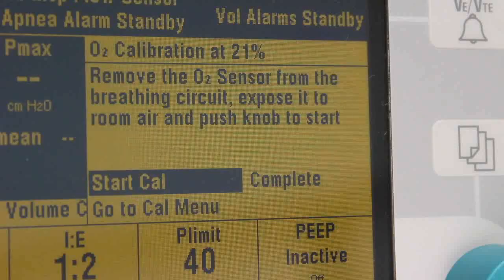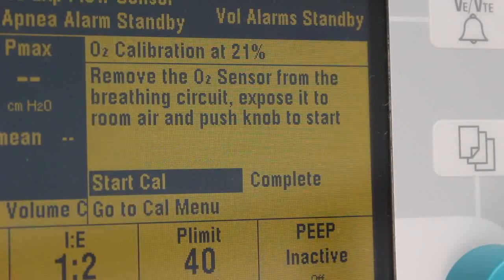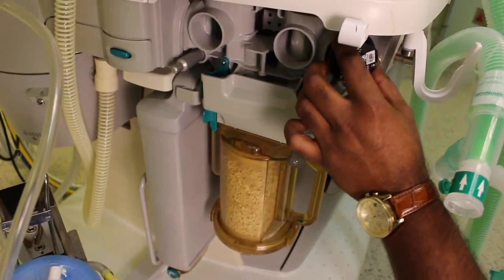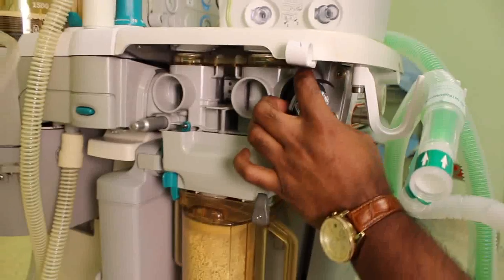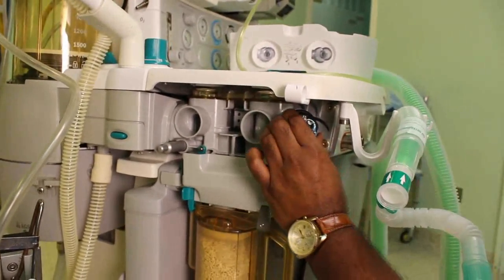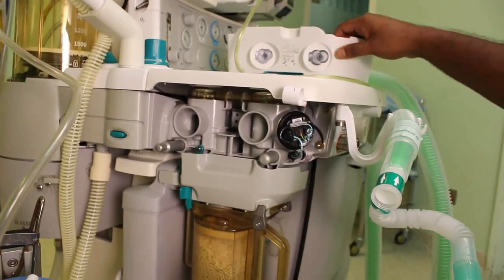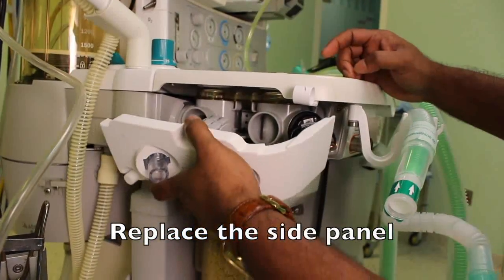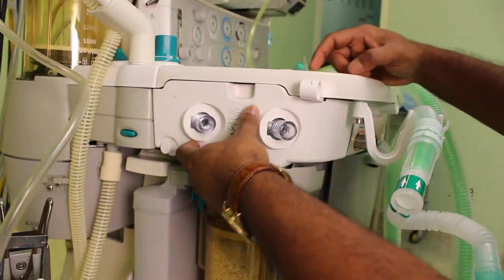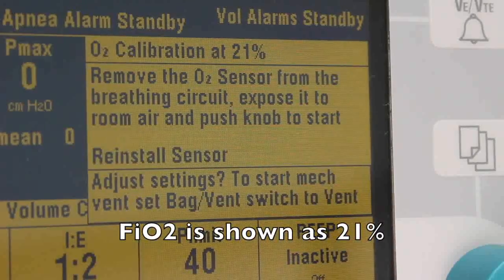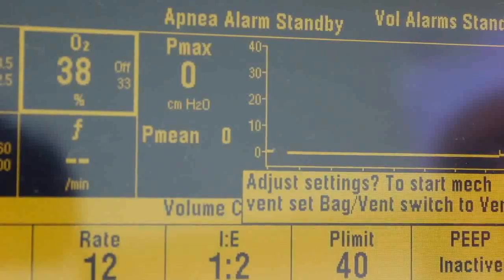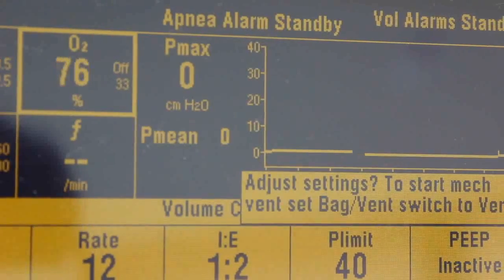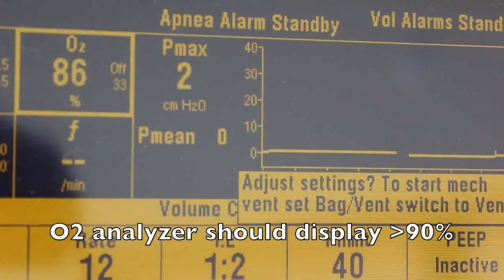Once completed, reinstall the sensor by rotating clockwise. Now replace the panel carefully. The oxygen analyzer is calibrated at 21%. Now increase the FiO2 by using the oxygen flush and see if the oxygen sensor reads above 90%.